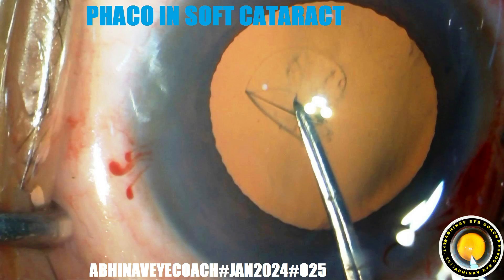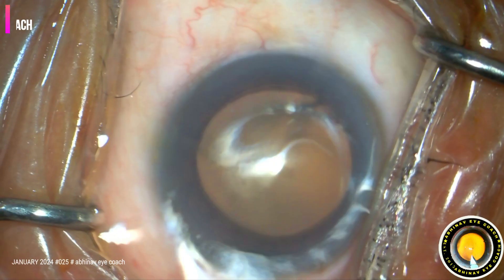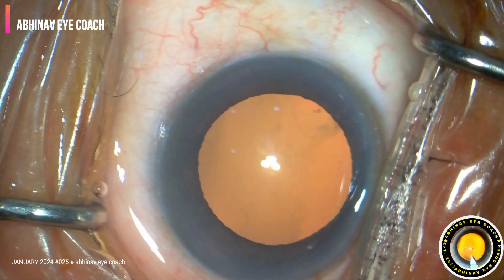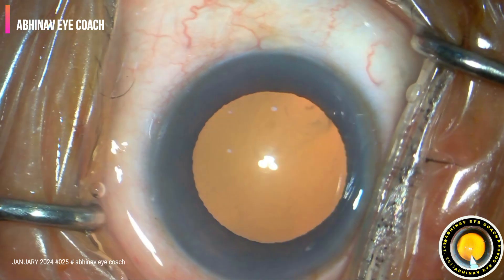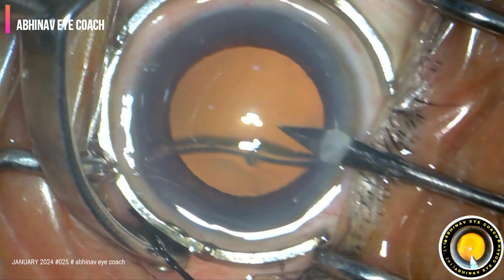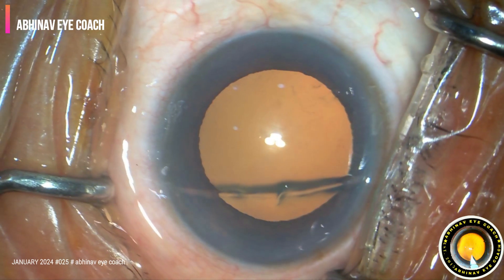Hi friends, I am Dr. Abhinav Prakash, going to share a surgical experience in performing a phacoemulsification in soft cataract. This is a soft cataract, 55 years male, grade 1 to 2 nuclear sclerosis.